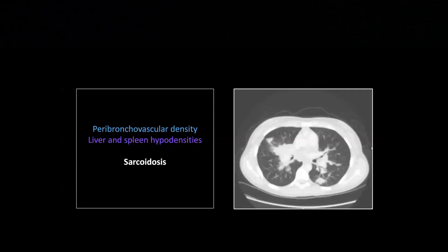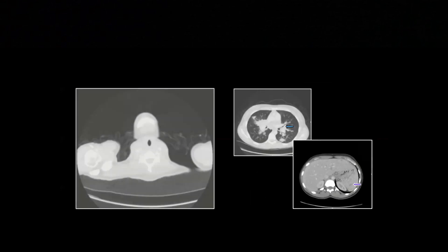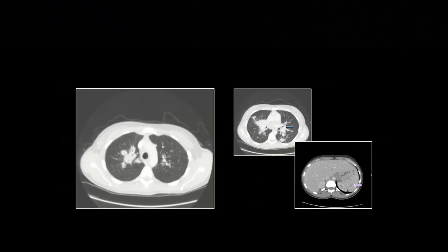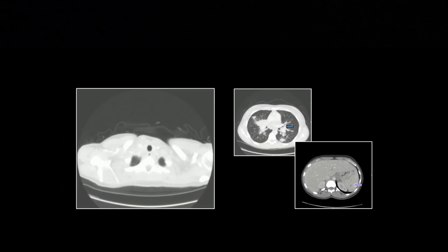Here's another sarcoid. Sarcoid is one of the great mimickers — it can look like almost anything. But when you see something that is really obviously peribronchovascular, that differential list is actually pretty short. When I see peribronchovascular density, I basically think of sarcoidosis, Kaposi sarcoma, and lymphangitic tumor — it's almost always going to be one of those three. There is the peribronchovascular density tracking out along these bronchovascular bundles. And we have liver and spleen hypodensities here, similar to the last case but not as extensive. Look at it tracking all out along the bronchovascular bundles with a certain nodular character to it.